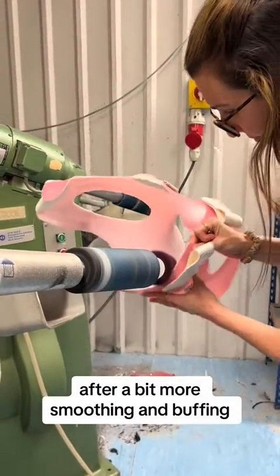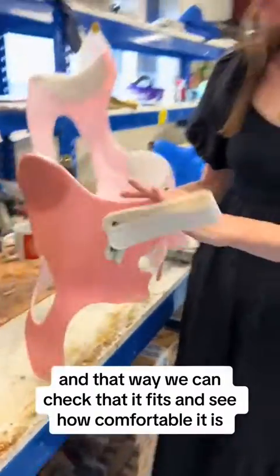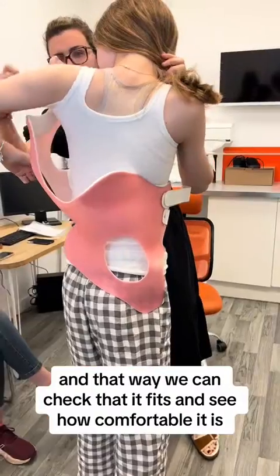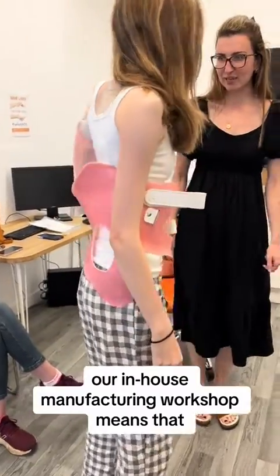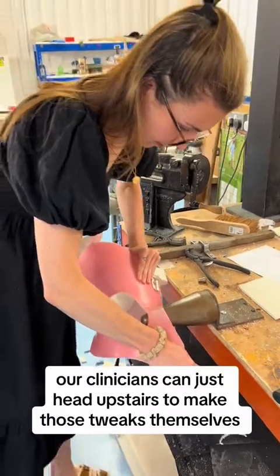After a bit more smoothing and buffing, Anna takes the brace down so the patient can try it on, and that way we can check that it fits and see how comfortable it is. Our in-house manufacturing workshop means that if we do need to make any more adjustments, our clinicians can just head upstairs to make those tweaks themselves.